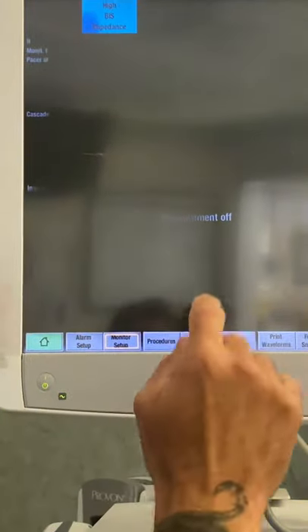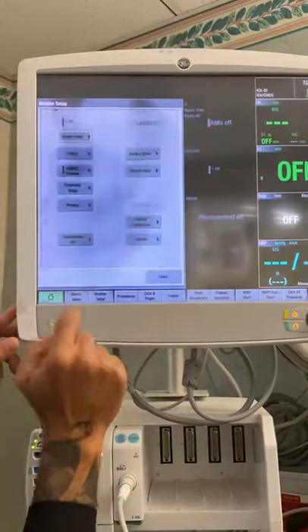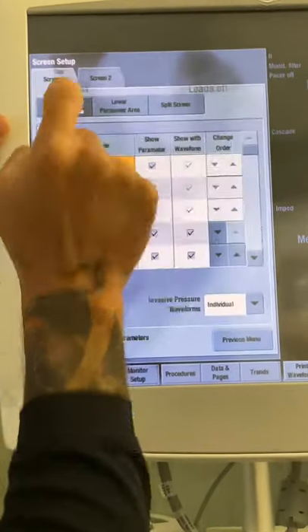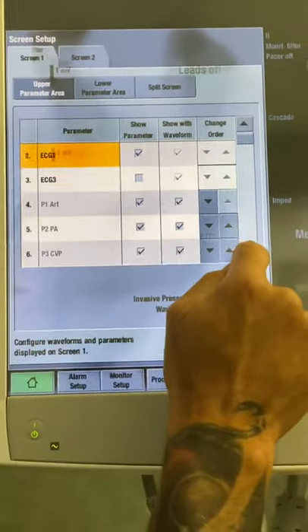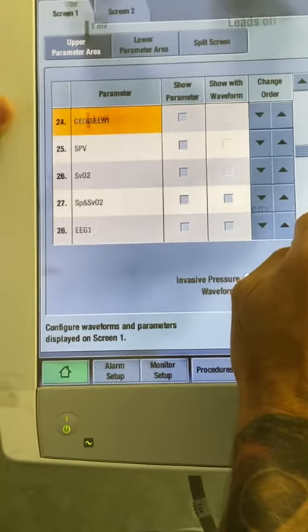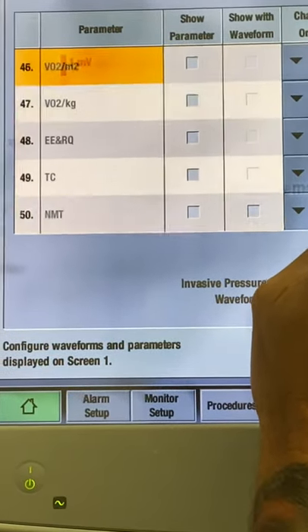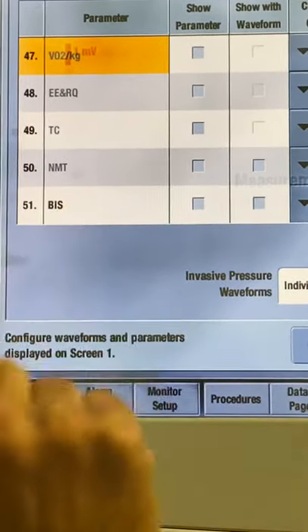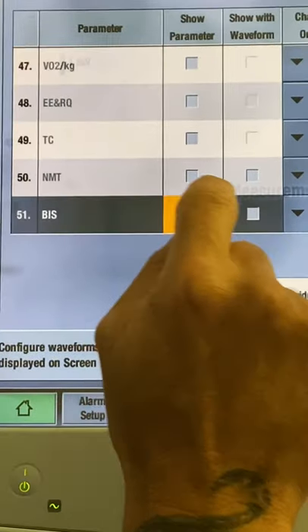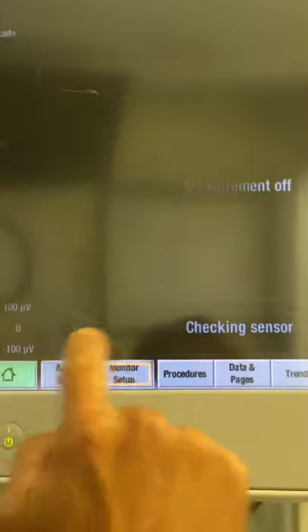So now it's still not populating. So now what are you going to do? You're going to go to monitor setup, screen setup, and you're going to go all the way down, all the way down, almost to the bottom. And there it is, BIS. You're going to click on show parameter and show with waveform. And now it's right here.